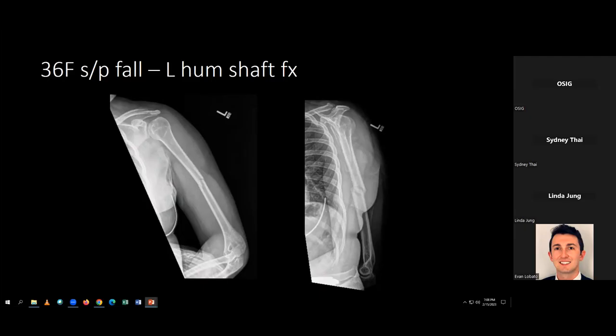You can see on these images, you want to look proximally, meaning closer to your body. So that's the shoulder. You can see the distal end of the clavicle, which is right here. And then it meets, this is the AC joint right here. AC meaning acromion, which is this bone, and that wraps around. That's part of the scapula. And then C meaning clavicle. So you're looking at this joint.